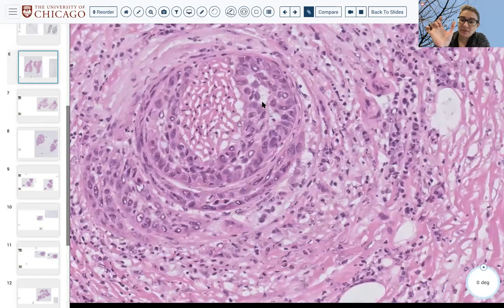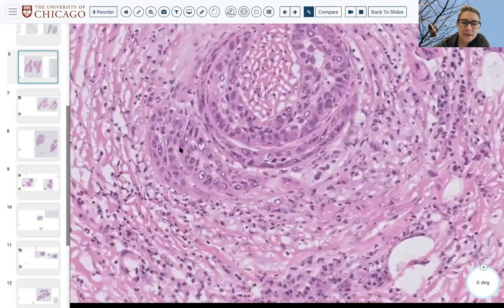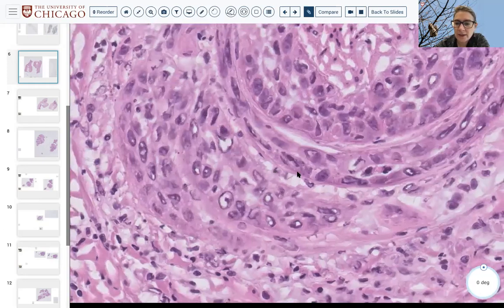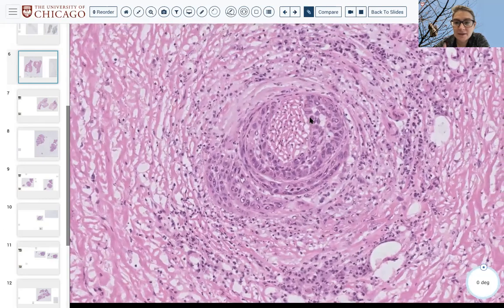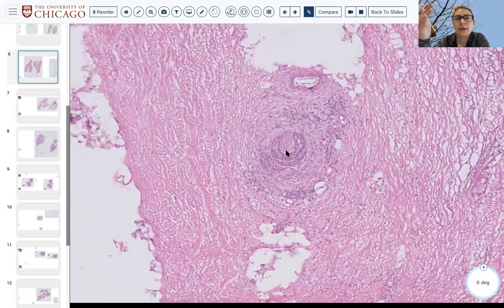Just based on the shape of this, what might it be? Hopefully you can all identify this as carcinoma, highly atypical, large. Looks like maybe nerve invasion. Yes, I see written and I heard perineural invasion, exactly. So a good low power. Not that PNI is necessarily going to be important on your frozen, but if specimens are cauterized or it can be challenging to know what's tumor and what's not tumor, sometimes the shape of the cells can help you.